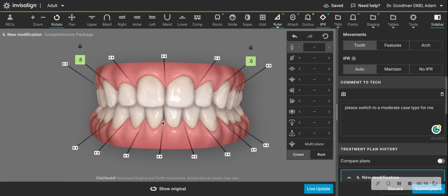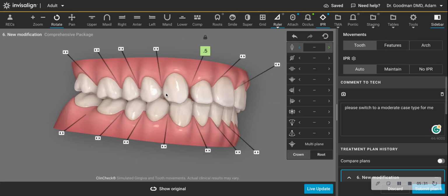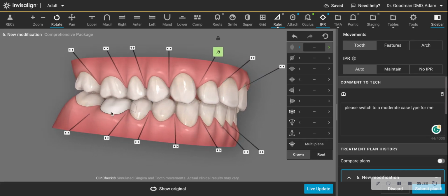It's the lower, barring unless there's a missing tooth. If the lower midline is off, it is the lower midline that's off in this case, and you wouldn't want to move the upper midline over, and that's what would happen if you distalized trying to get into a class 1 here. You can give a child elastics to bring the mandible forward, but not an adult.